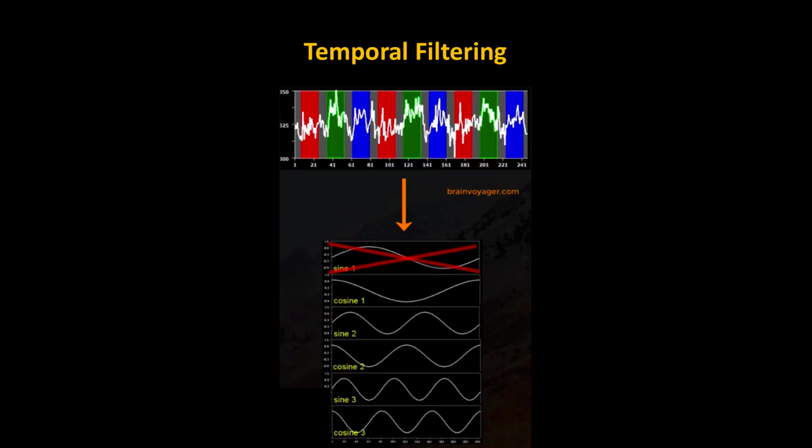If you remember that design matrix I showed you, right, we had a lot of regressors showing which frequencies were being regressed out of the data. And there were some very slow ones, and there were some very high frequency ones. It's not covering all of them. It's not continuous, but it does its best to remove the representative ones.